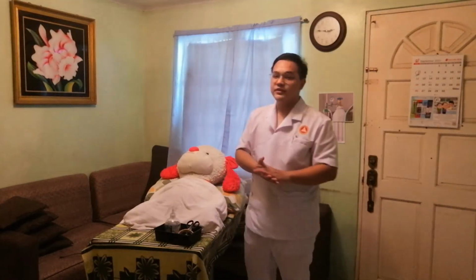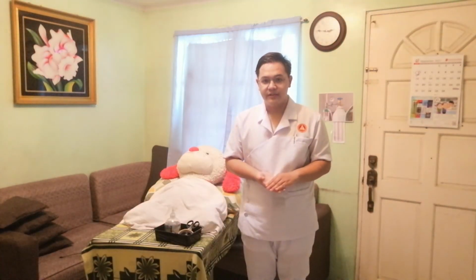Good. And after that, we will move on to our next step, which is we need to inspect our equipment on a regular basis. Okay? And the first thing that we need to check is the liter flow and the level of water inside the humidifier every 30 minutes and when we are providing care for our client.